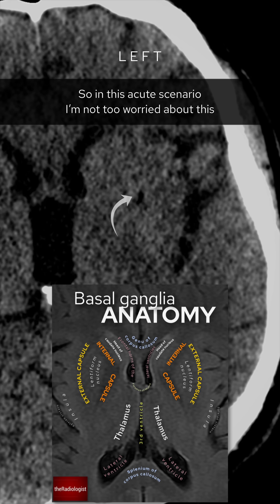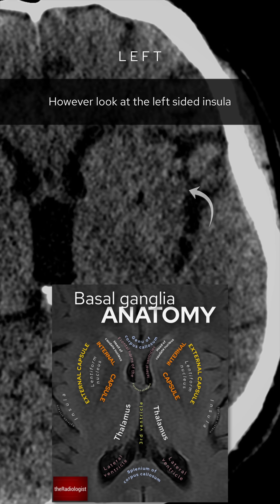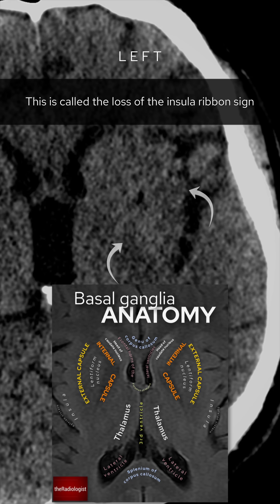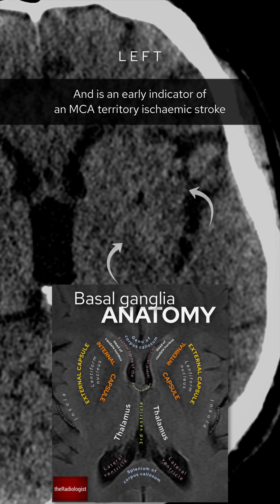In this acute scenario I'm not too worried about the lacunar infarct. However, look at the left insula — it's a similar density to the internal capsule. This is subtle but abnormal. This is called loss of the insular ribbon sign and is an early indicator of an MCA territory ischemic stroke.